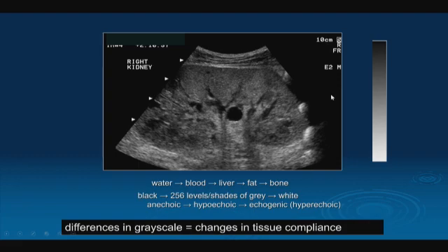And as we get into talking about more scan fundamentals, what you'll see is in the abdomen, we use the liver as our standard benchmark for normalcy. All other organs are compared to the liver to determine if they're normal or abnormal, providing that the liver is normal. When the liver is big, it occupies the entire right upper quadrant. So it's easy to compare, and it's easy to adjust your gain controls to the liver as your standard before you go on. Then you know you got everything set appropriately.